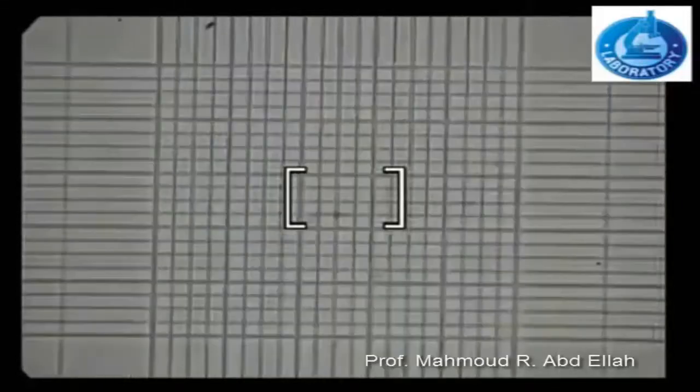This is the central area of the counting chamber, which consists of 25 equal squares. Every one of them is divided into 16 equal squares.